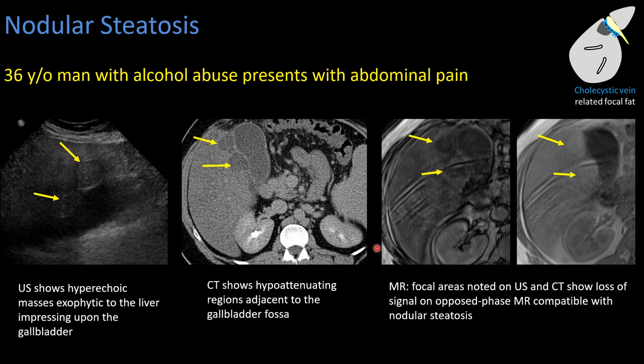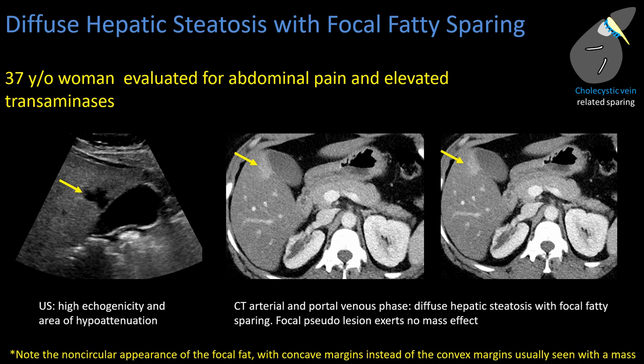This patient has diffuse hepatic steatosis and was being evaluated for abdominal pain and elevated transaminases. The liver is diffusely echogenic with loss of periportal fat, and along the gallbladder fossa there is a non-circular region of hypoechogenicity.